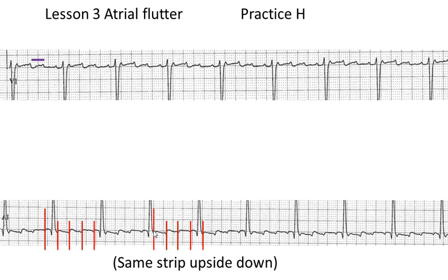We try to measure them to come up with a ratio of how many flutter waves are occurring for each QRS. We need to start and end at the same place in relation to the QRS, because we're trying to get a relationship between how many flutter waves there are for each QRS.